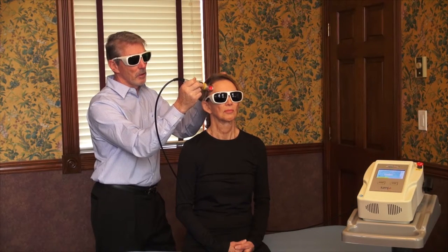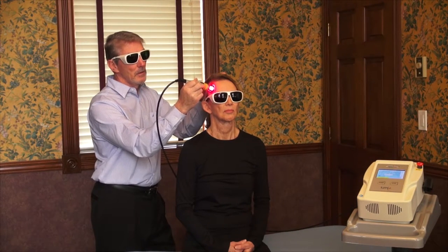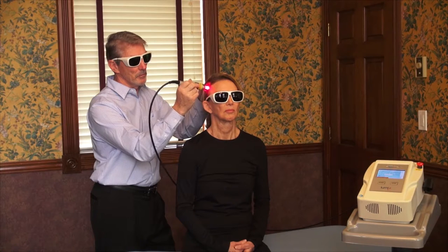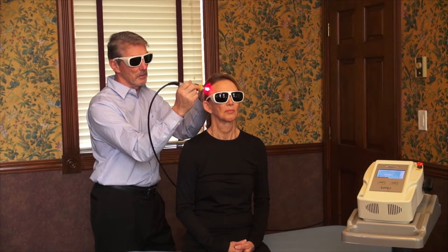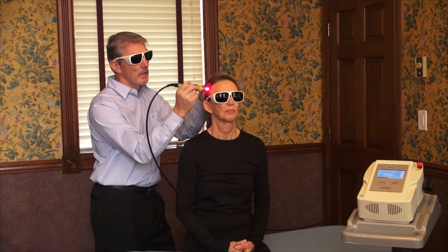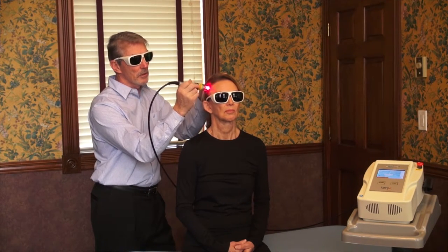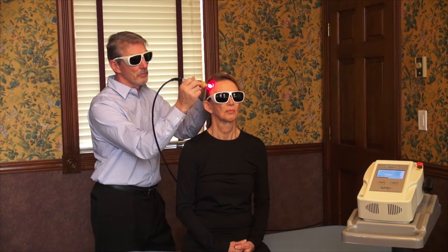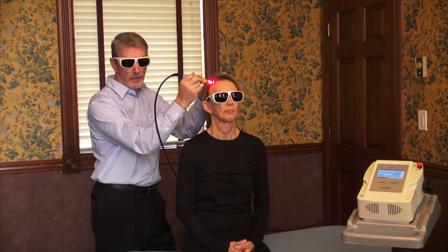Hair blocks and absorbs laser to some extent, so I will always get less energy when I'm over the hairline and may need to spend a little longer. Using small rotational motions allows me to go between the hair and get more energy into the temporalis region as well.